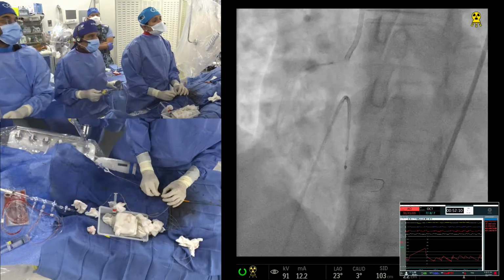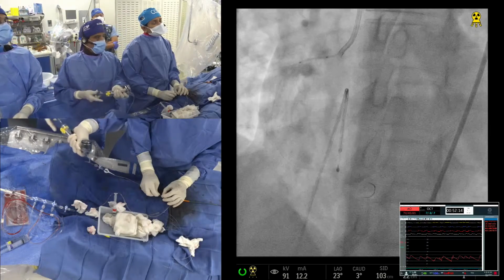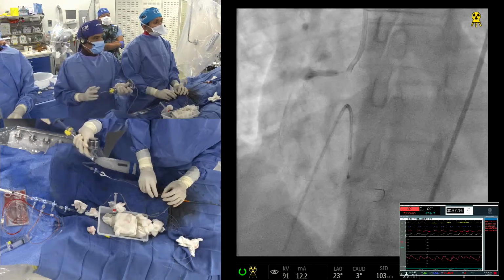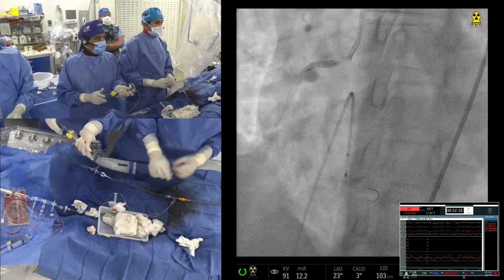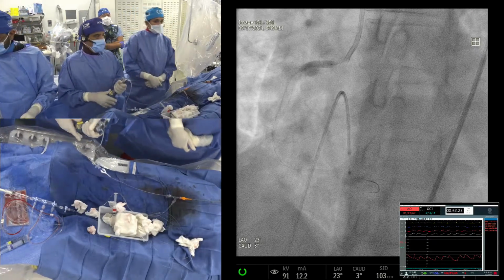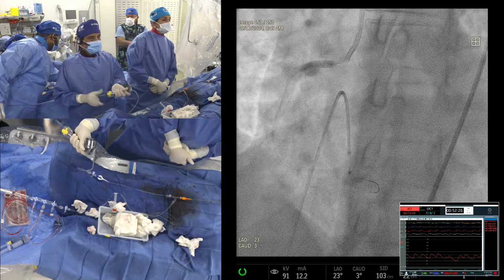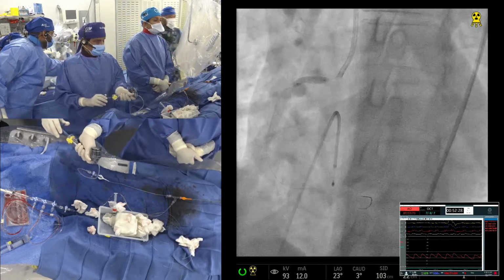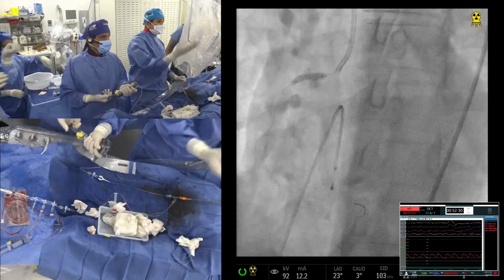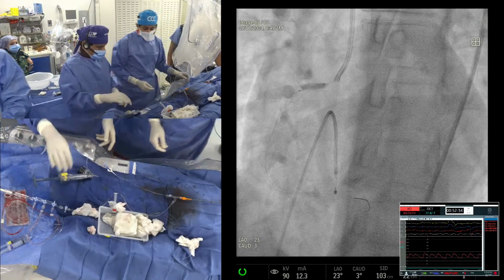No, that's different. Then you can go to second. Just because the OCT did not cross. That's because of that. Otherwise, we don't do that. Let's go a little forward. We also teach when you see tram track calcium, you don't have to do imaging, just go directly with the burr. Let's go further.